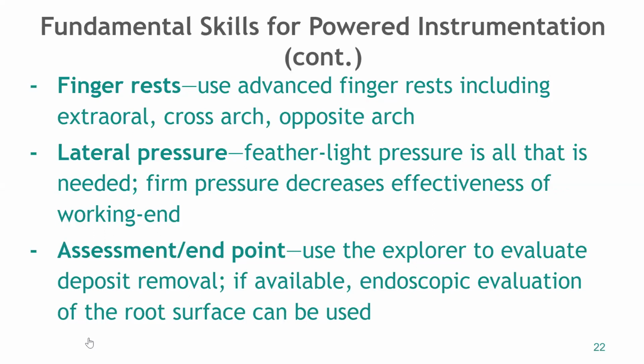But especially at first, when you guys are still developing this tactile sensitivity, it's so important to make sure that if we're going after a big piece of calculus that we can see in the radiographs, we're exploring, Cavitroning, and then exploring again to make sure that we get it. And then also using our hand instrumentation after so that we can smooth the surface completely.